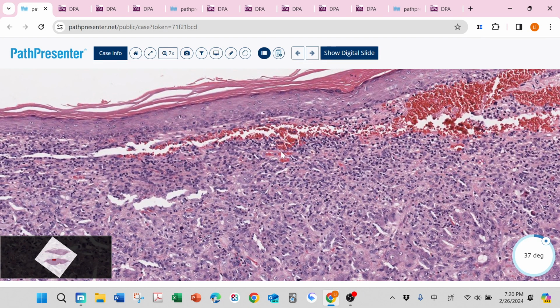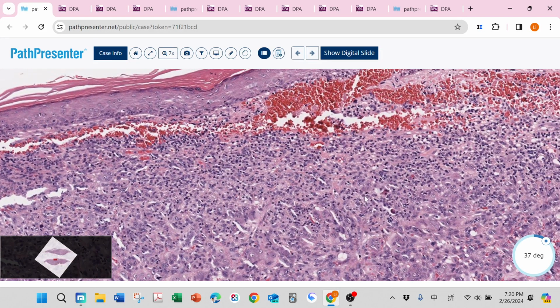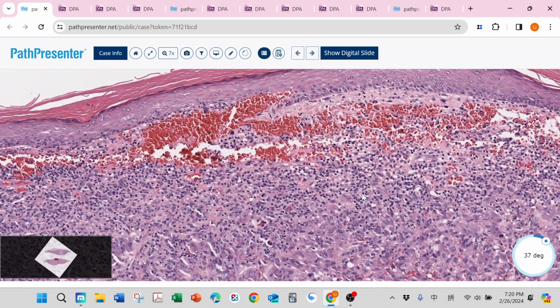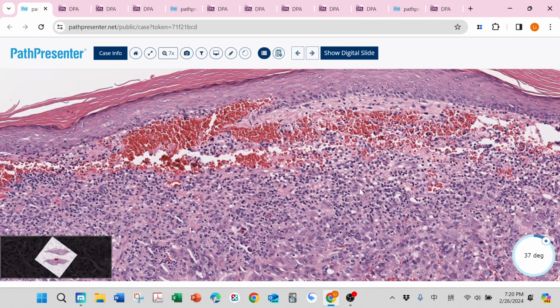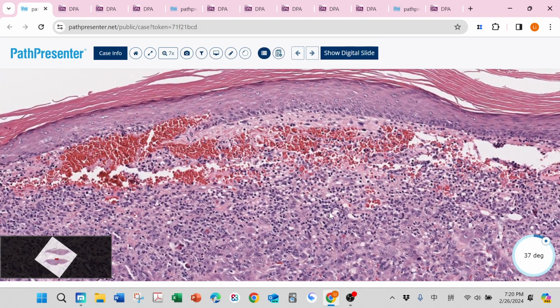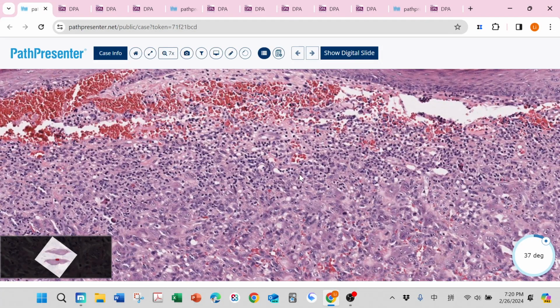S stands for squamous cell carcinoma, especially this spindle cell looking, that should be high-grade spindle cell squamous cell carcinoma. L is leiomyosarcoma. And A is AFX. That is the topic of this slideshow, AFX, atypical fibroxanthoma.